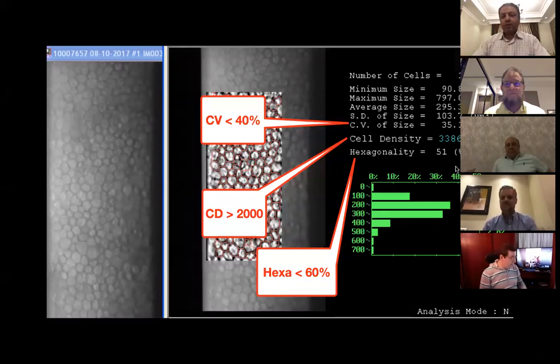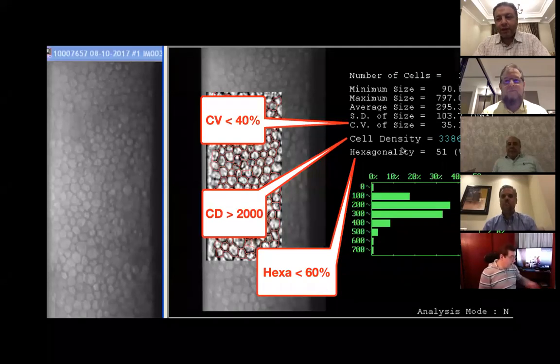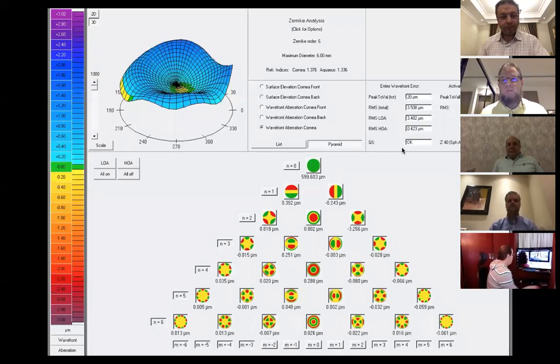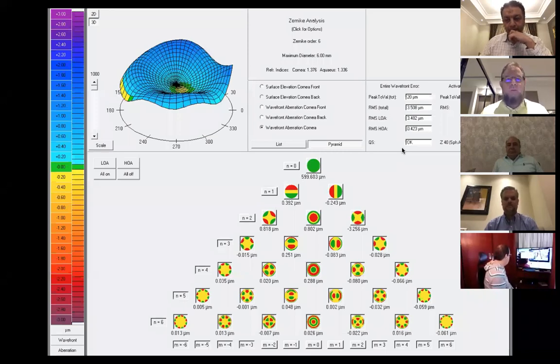Okay, sir, I think this point is fully clarified now. We can go for another one. Now, let's say that we are going to implant a lens-based procedure for the patient. Of course, one of the main investigations that we have to study is the corneal wavefront, even if we are planning for phakic IOLs, or we are planning for clear lens extraction and premium lens implantation.